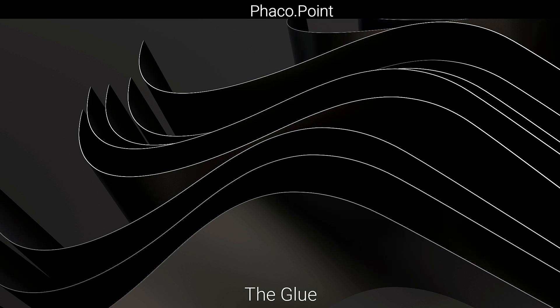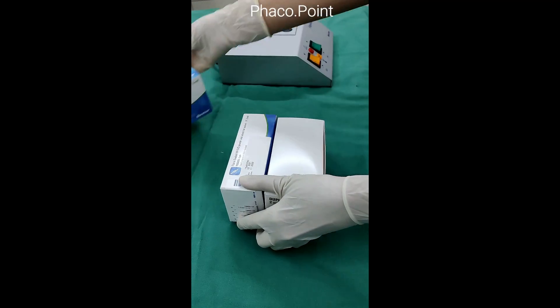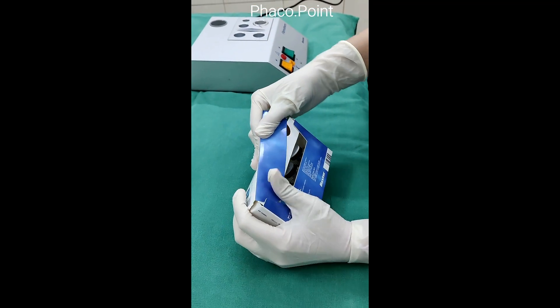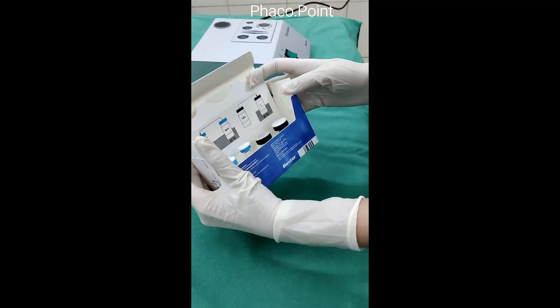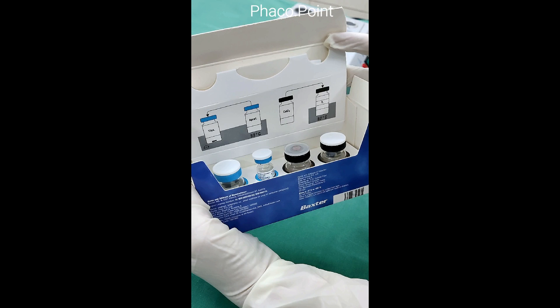Let's now understand the constituents of the glue. The kit consists of two boxes. Within the pack we find four vials — two with blue stoppers and two with black. The two blue are mixed with each other and the two black are similarly mixed with each other.